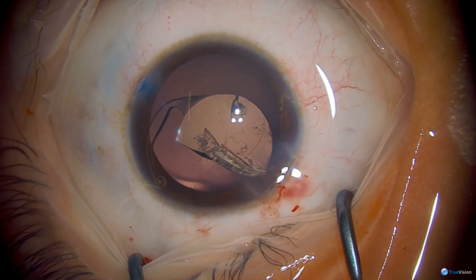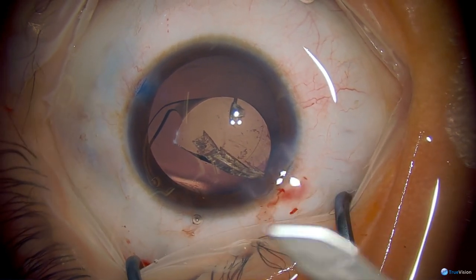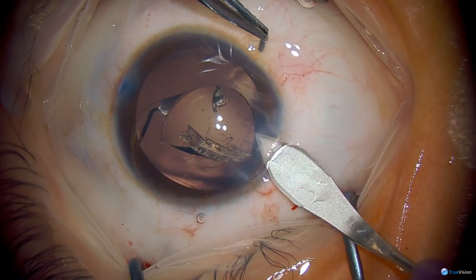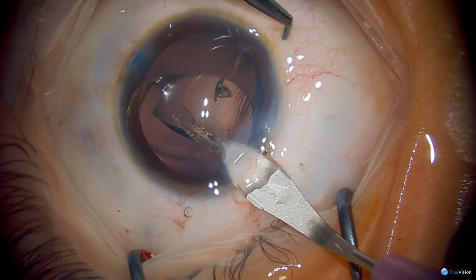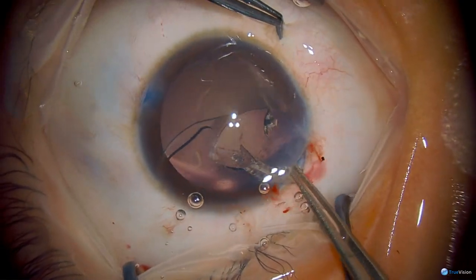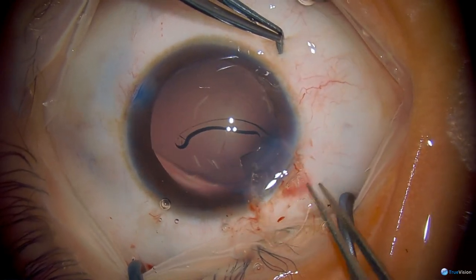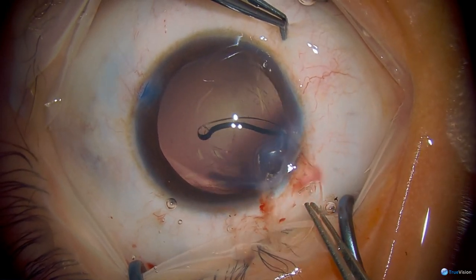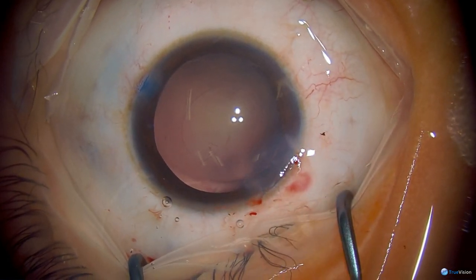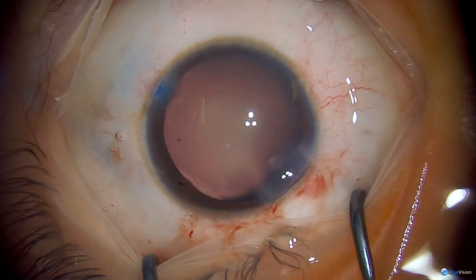Here you can see that the halves are a little bit unequal, so the wound is being enlarged slightly to allow a less traumatic explantation of the larger jagged piece. You don't want to be dragging this across the endothelium of the cornea. The surgeon is doing a nice job of wheeling that out. There's also a technique of only cutting partially across the IOL and then cartwheeling the two halves out while they remain attached. You just have to be careful not to contact the endothelium when you do that.